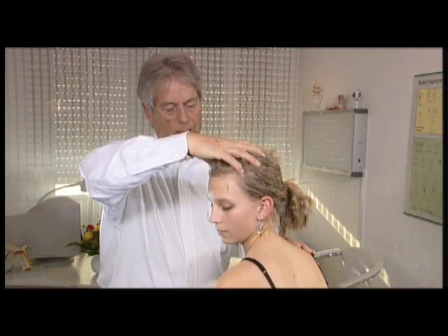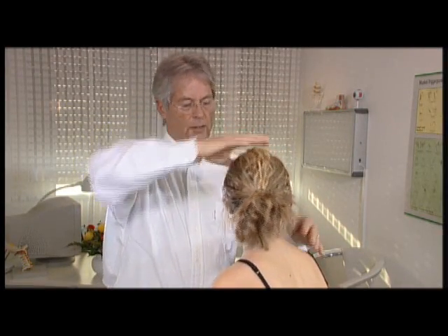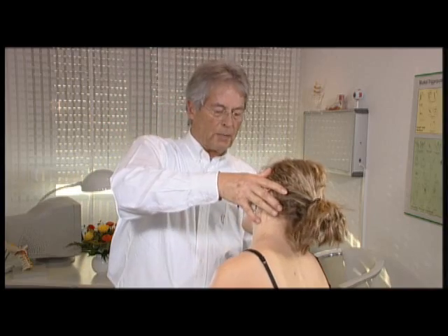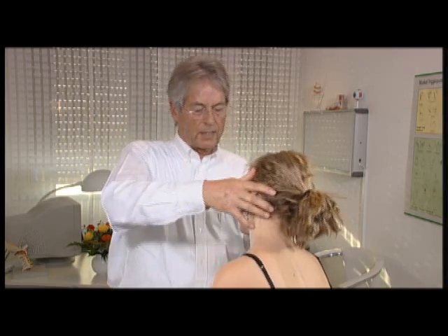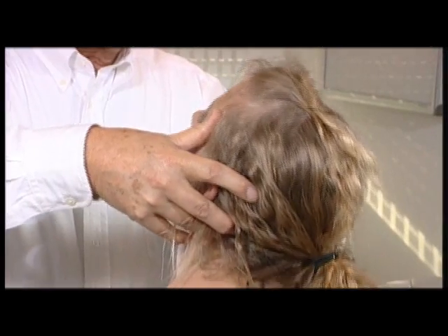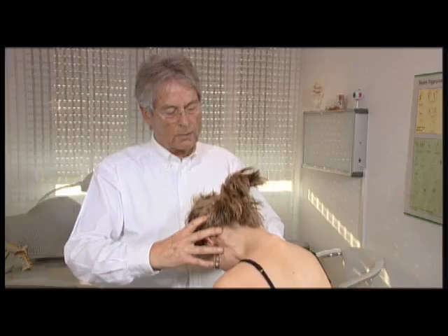Funktionsuntersuchung, Drehung nach links frei. In the case of this competitive athlete, the functional examination revealed a pronounced limitation of the range of motion when the patient turned her head to the left and right, as well as limited sideways mobility. Und das zieht hinten.